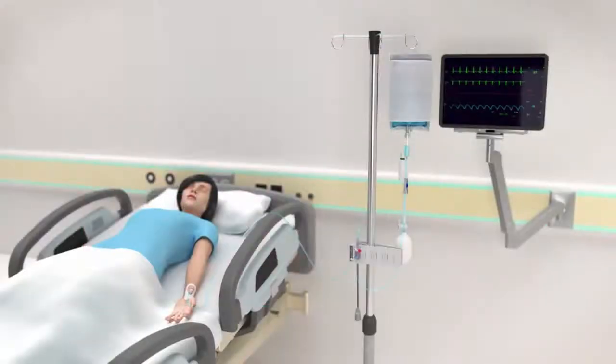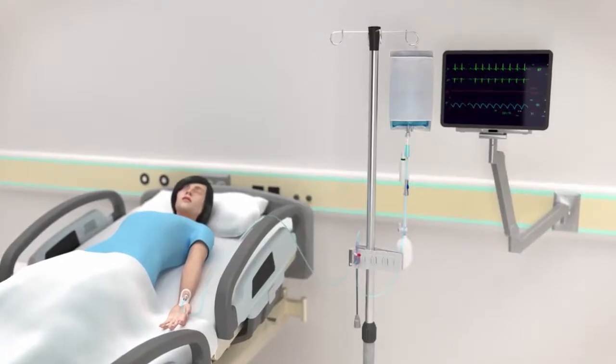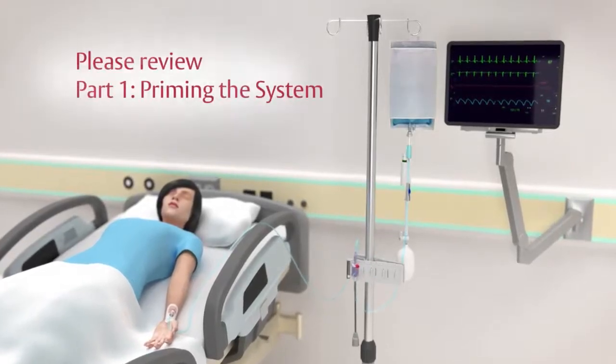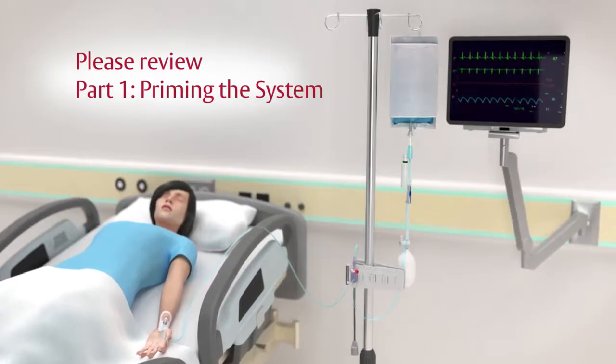Before connecting the TruWave Transducer to a bedside monitor and calibrating the system, it's important to prime the system properly. If you haven't already done so, please follow the steps in Part 1 of this video series, Priming the System, to complete this procedure.